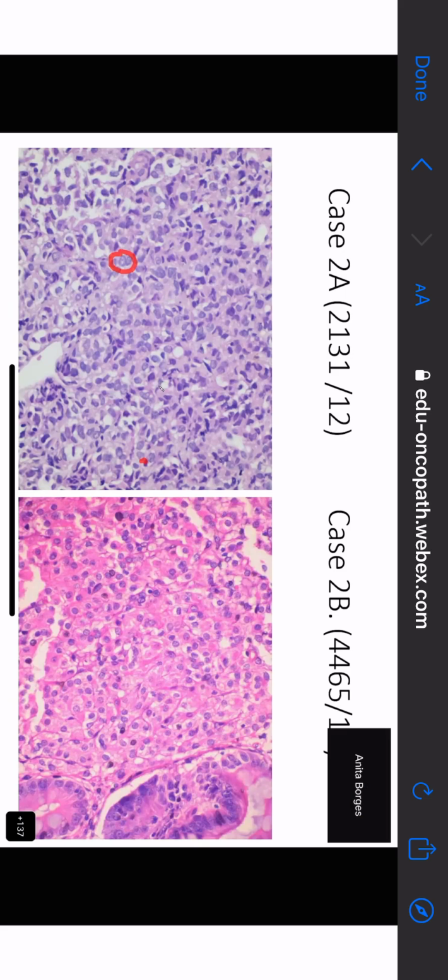I won't say that there is a lot of pleomorphism. Pleomorphism does not really come to me as a diagnostic term that I would use, but there is anisonucleosis. The shapes are also different. Some of them are round, some of them are irregular, some of them are oval. And I would not say that there were prominent nucleoli, because the nucleoli just don't jump out at you.